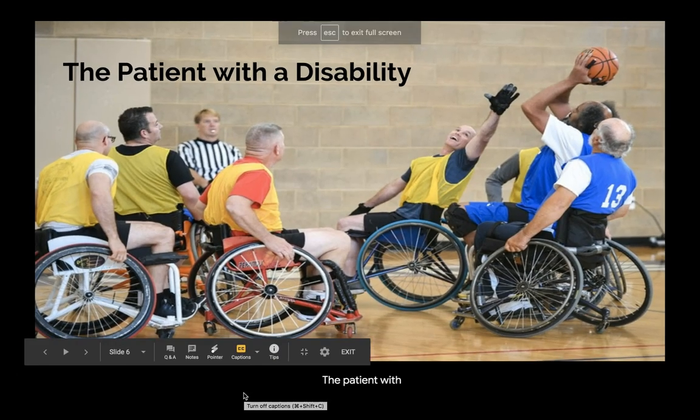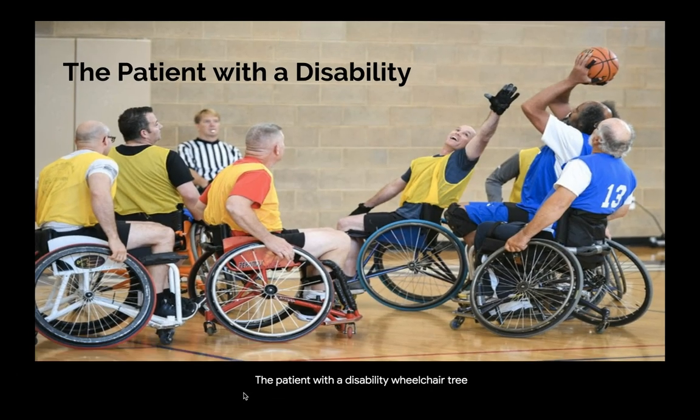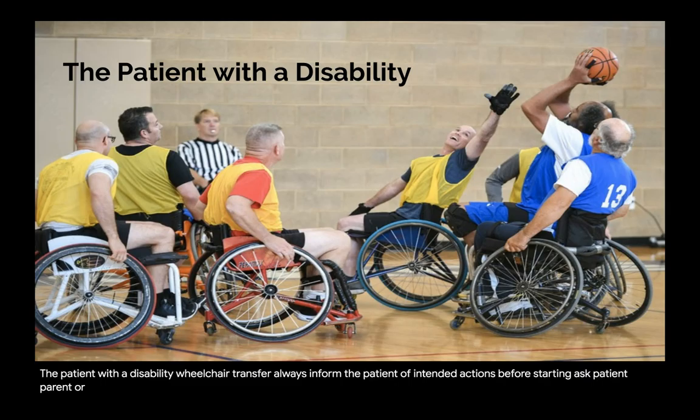The patient with a disability, wheelchair transfer. Always inform the patient of intended actions before starting. Ask the patient, parent, or caregiver the preferred transfer method and ability to help with the transfer.